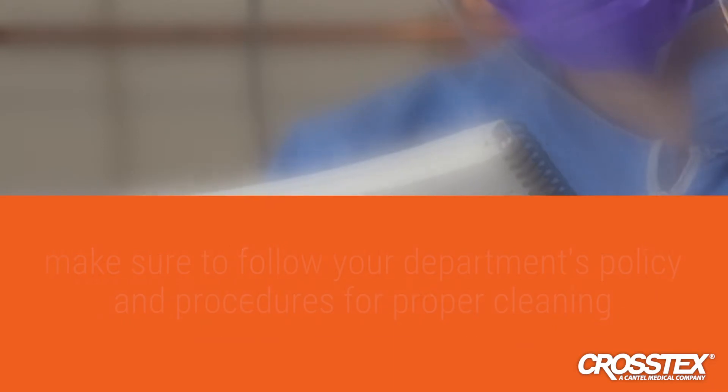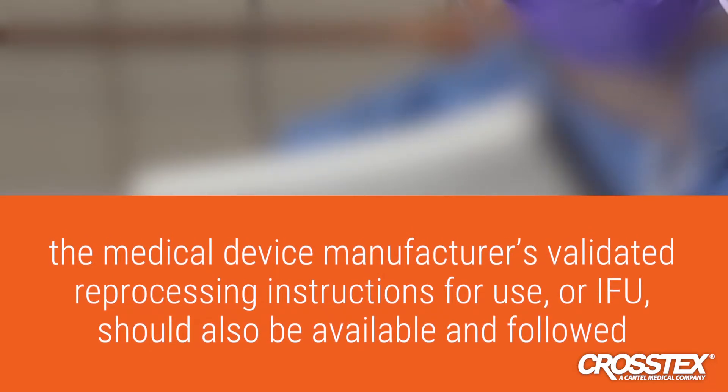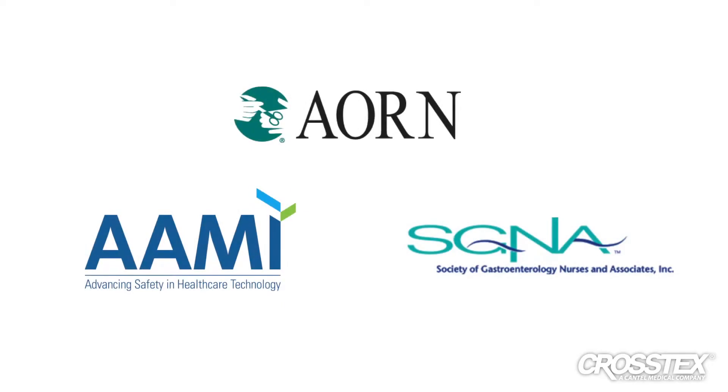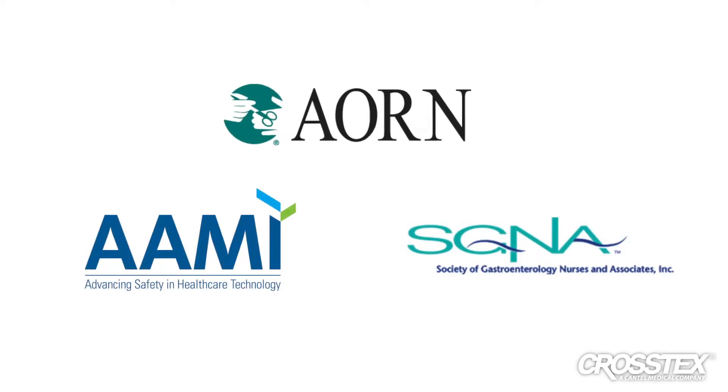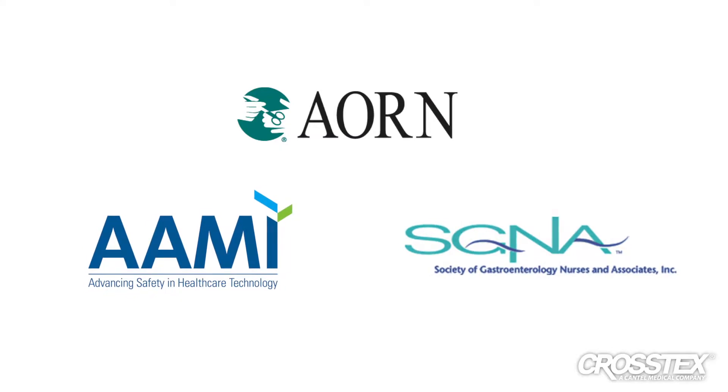The medical device manufacturer's validated reprocessing instructions for use, or IFU, should also be available and followed. General cleaning and decontamination guidelines are available from industry associations such as AORN, AAMI, and SGNA for additional information about cleaning standards and practices.